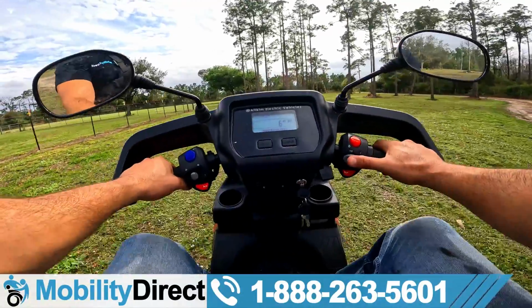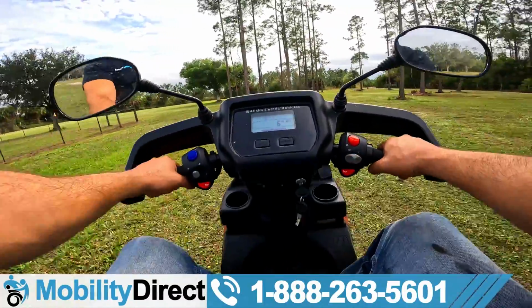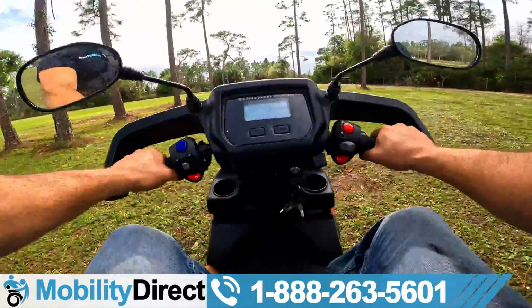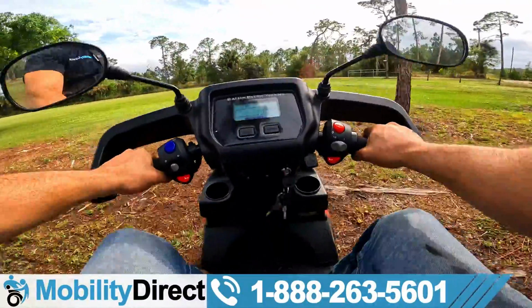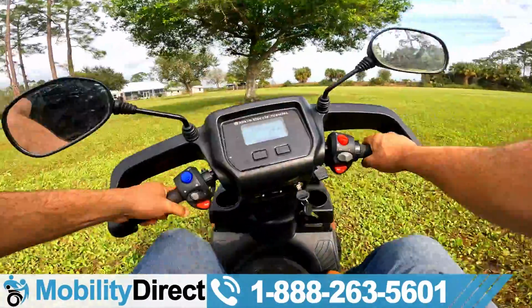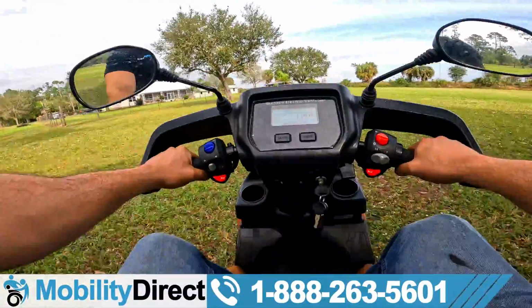of terrain. And now that the battery connection is secure, I'm going to test it to make sure it does handle well even on the roughest terrains. I've got the speed all the way up now, and guess what? No error 1 code, no intermittent shutting down of the unit. I'm going to go over this log. Look at that. We just went over about a 12-inch log, and it's still holding up just fine. I'm going almost 12 miles per hour.